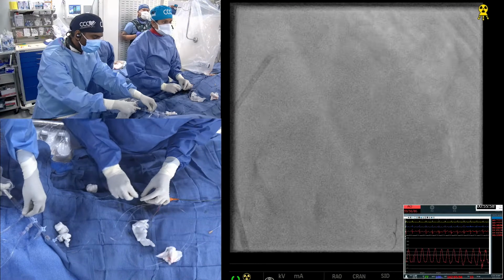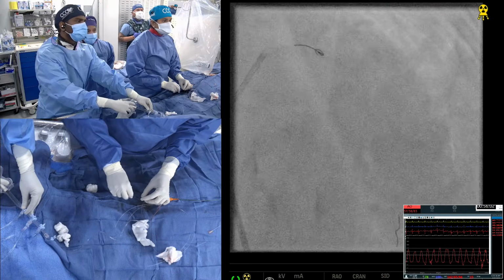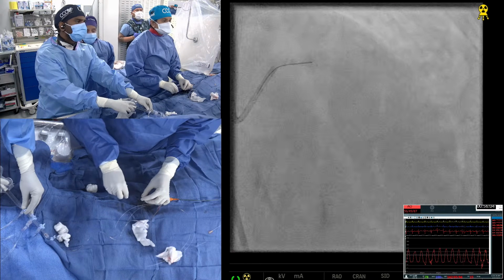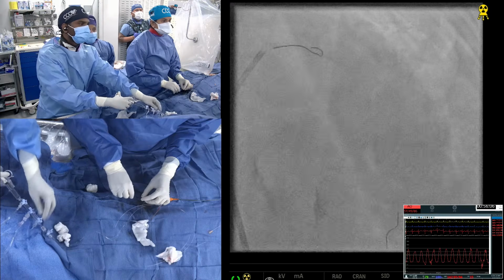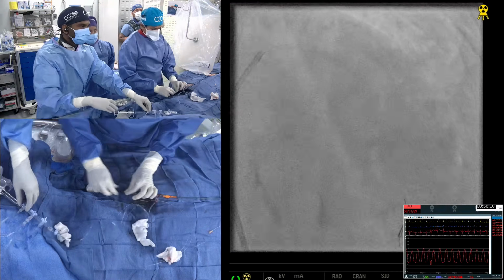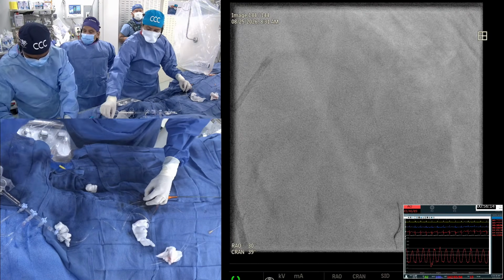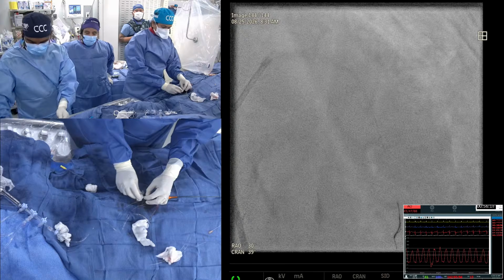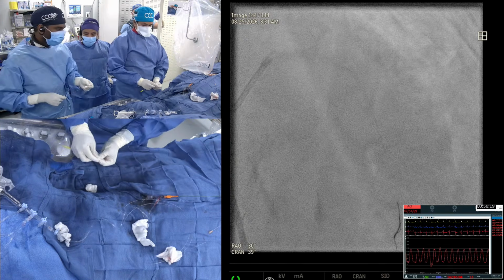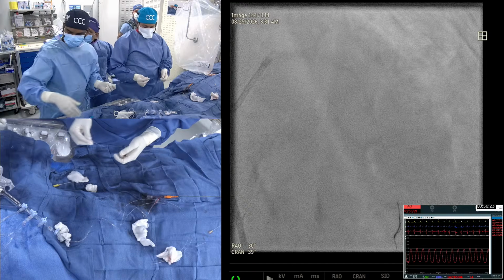The question is, many times when you are doing a rotablation, the technician, not knowing it, increases the speed when the RPM starts going down. I say absolutely wrong. That should not be done, because that defeats the whole purpose. You want to make sure you are not causing excessive plaque material ablation. So clearly, do not change the speed. Speed you just set outside.